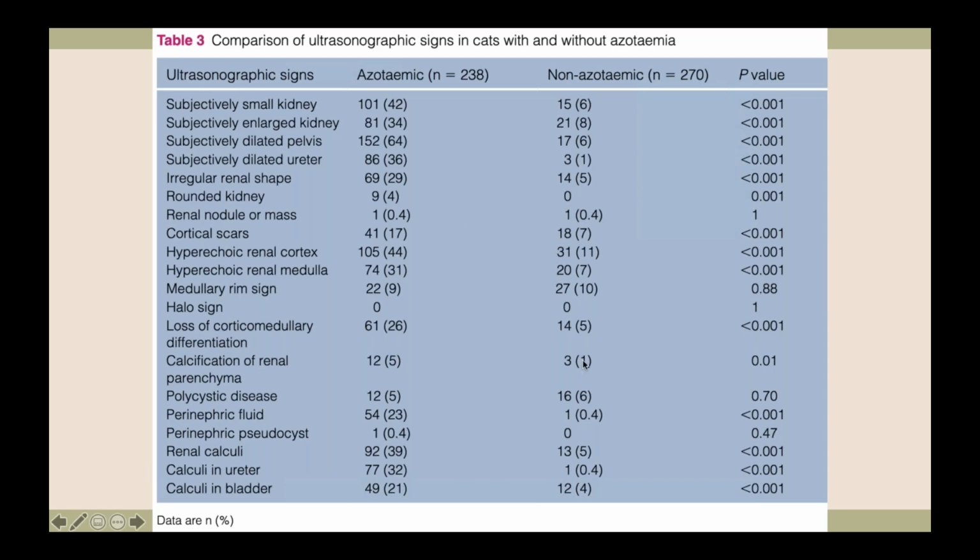But looking at the entire population of non-azotemic cats, the majority of them would have at least one of these findings, as you were moving forward to say, yes, this is something that is not 100% normal overall.